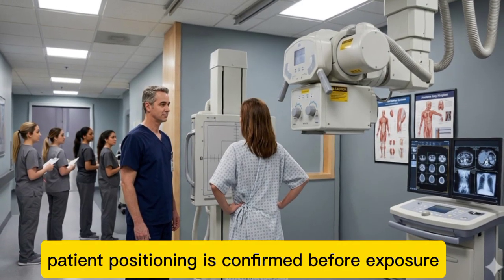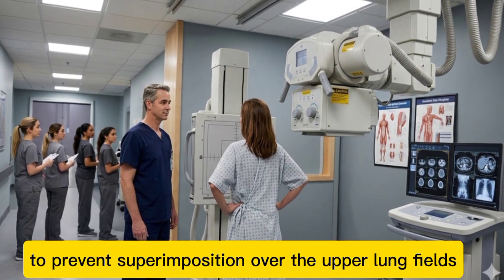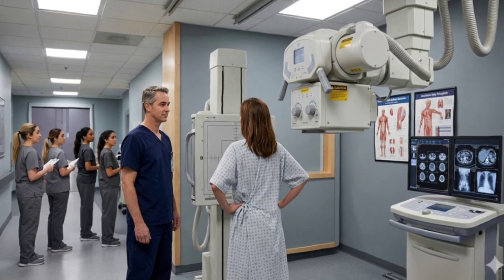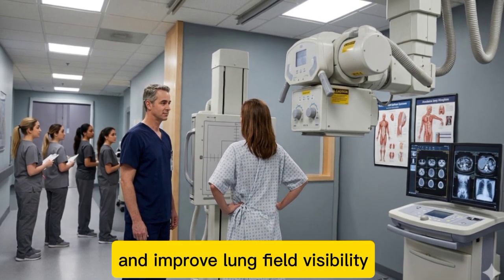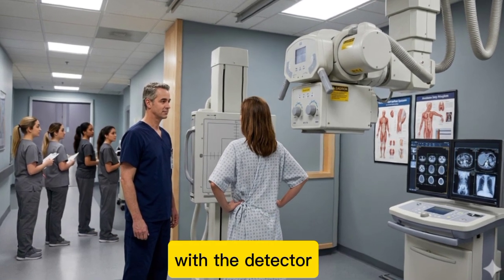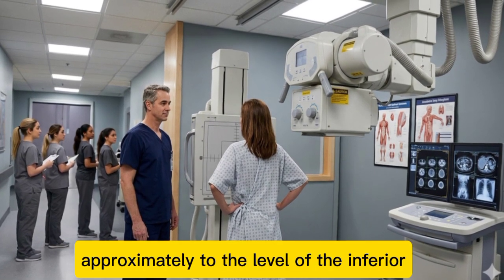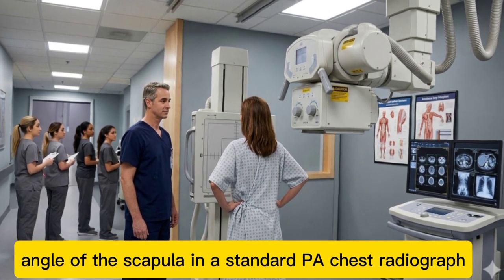Patient positioning is confirmed before exposure. The chin is elevated to prevent superimposition over the upper lung fields. The shoulders are rotated forward to move the scapulae laterally away from the lung apices. The hands are placed on the hips to further rotate the shoulders forward and improve lung field visibility. The anterior chest wall is placed in direct contact with the detector to reduce magnification and improve image sharpness. The central ray is directed at the level of T7, which corresponds approximately to the level of the inferior angle of the scapula in a standard PA chest radiograph.